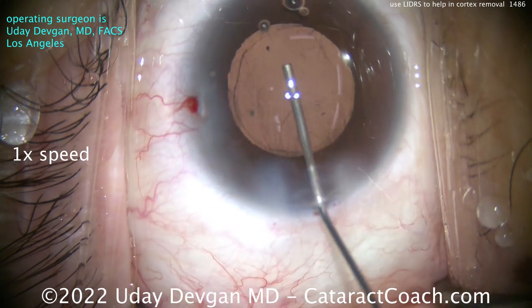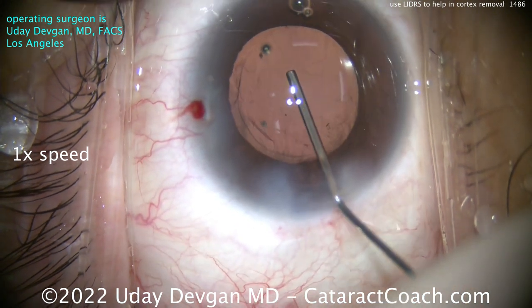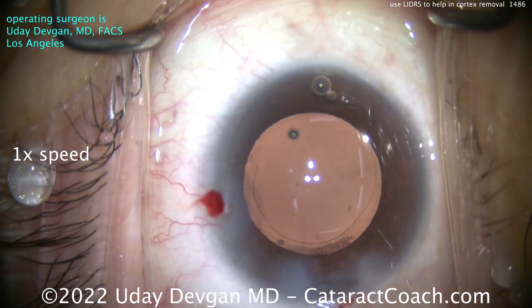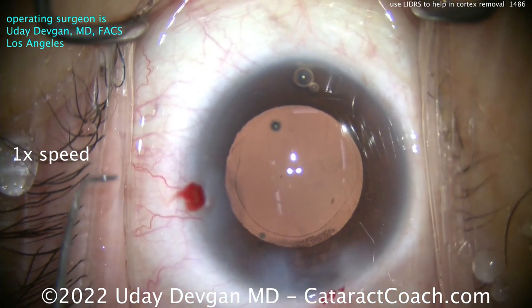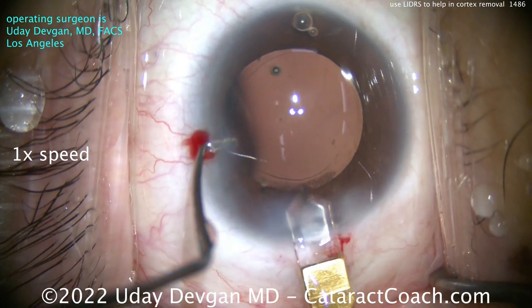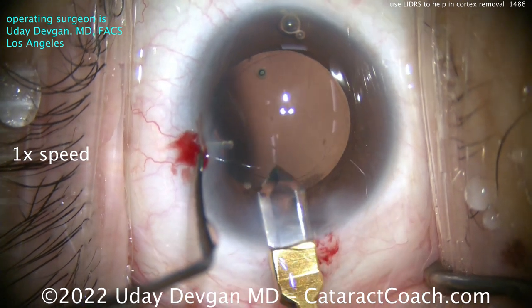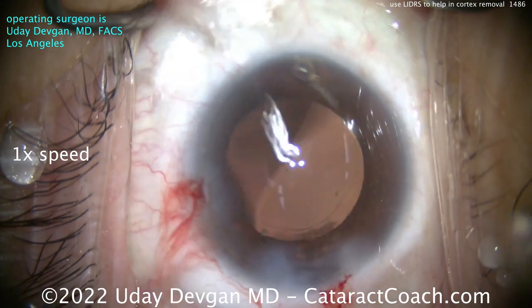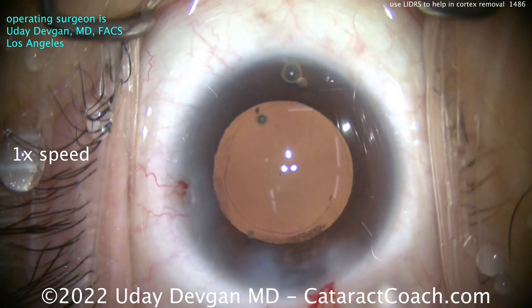Let's fill up the capsule bag with our cohesive viscoelastic. That will also help expand the pupil a little bit — give us some viscomydriasis. The lens going in requires a slightly bigger incision, so we'll just expand that just a hair.